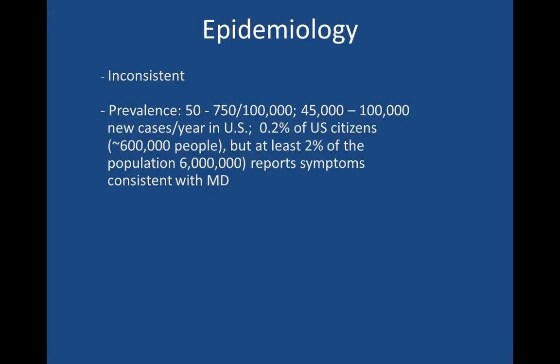alone. And one of the reasons I got interested in doing electrocochleography is that it seemed to me that if Meniere's had this much prevalence, and we were doing evoked potentials at the time, way back when, looking for the elusive acoustic tumor, we'd have a whole lot more application for our evoked potential unit than just doing ABRs, and indeed that is the case. I still think that most audiologists with evoked potential units do primarily ABR and not much else, whether that's ABR for diagnostic purposes in adults, which is not all that common anymore, but certainly for newborn hearing screening and things of that nature.